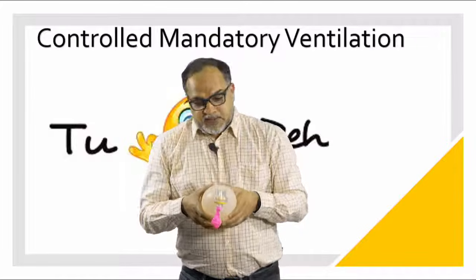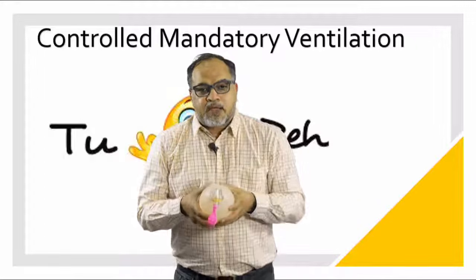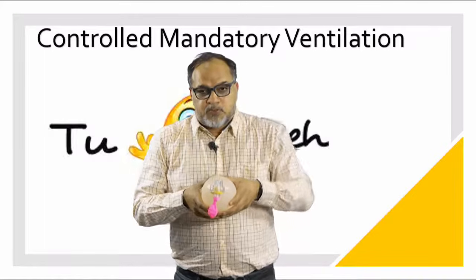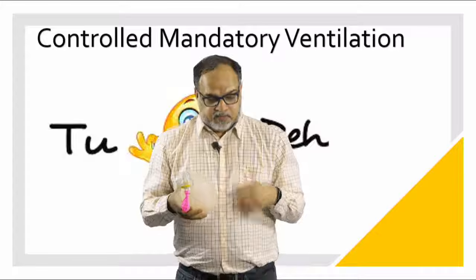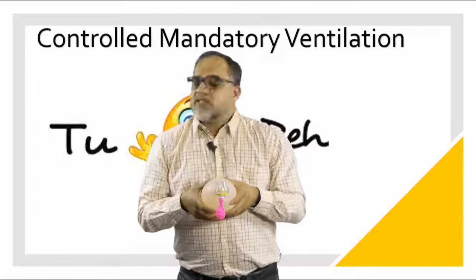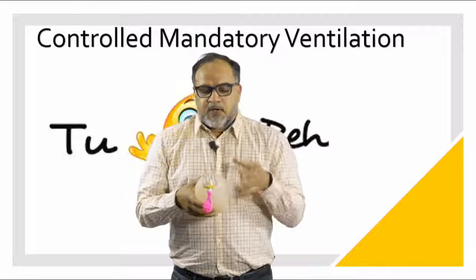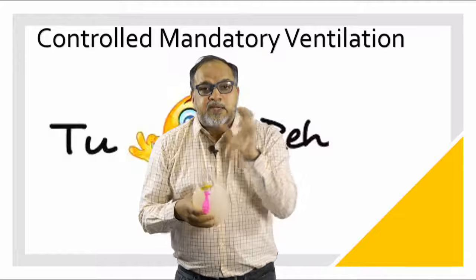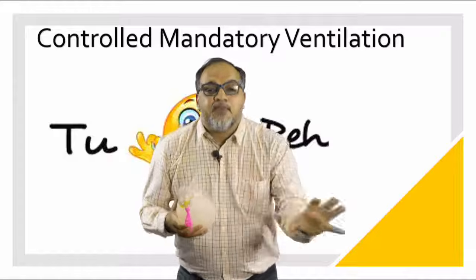Now what happens? Baba is trying to breathe in and the ventilator is in its 4th second. So 1, 2, 3, Baba tries to breathe out and the ventilator gives a breath. Again, Baba is upset. Now, again 1, 2, Baba tries to breathe in, but the ventilator says no, no breath till the 4th second. Okay, fine. Then the 3rd time, 1, 2, 3, Baba tries to breathe out, the ventilator gives a breath in. There is patient-ventilator dyssynchrony. Patient is really, really uncomfortable.